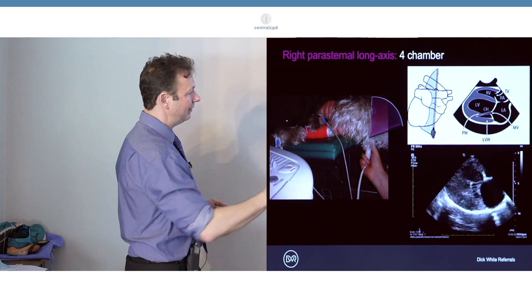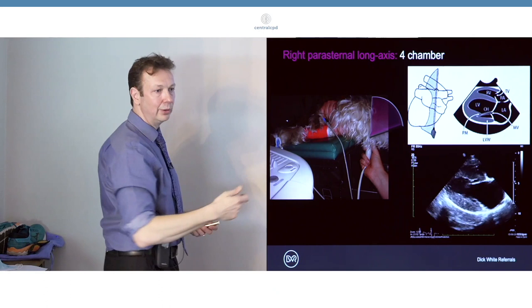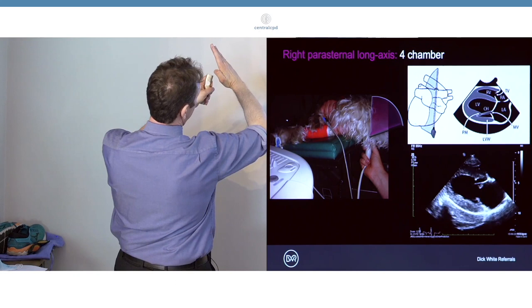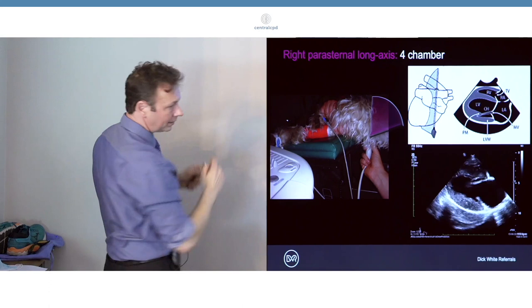If you're getting images that are very tipped or very oblique in orientation, it usually means you're not angling dorsally enough. Imagine the heart sitting like that - if you are imaging like that you'll get an oblique image. You want to turn it around more like that. So if you've got a tipped image you usually need to tip up, tip back.